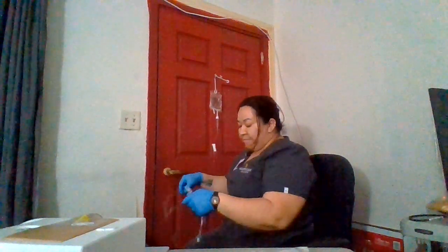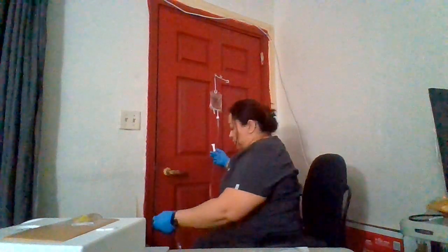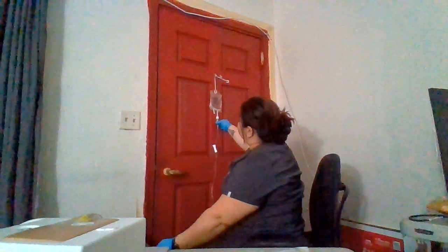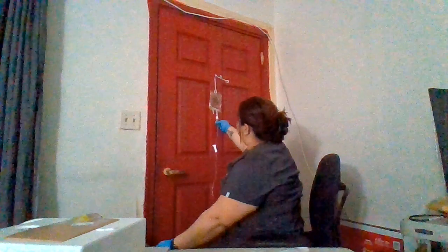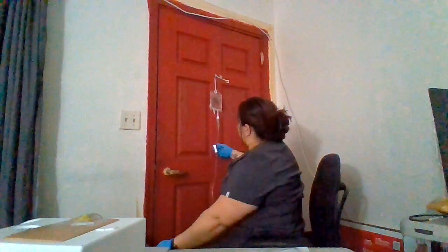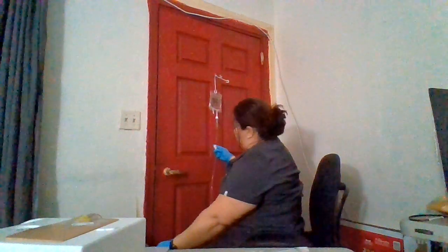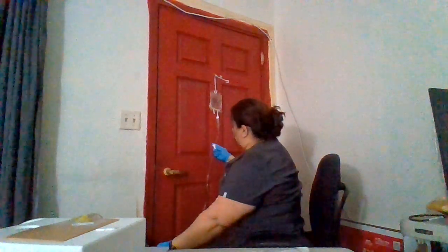So now the next step is to prime my tubing. I'm going to start off by squeezing the drip chamber and filling it to at least halfway. Then I will be rolling up the clamp slowly.